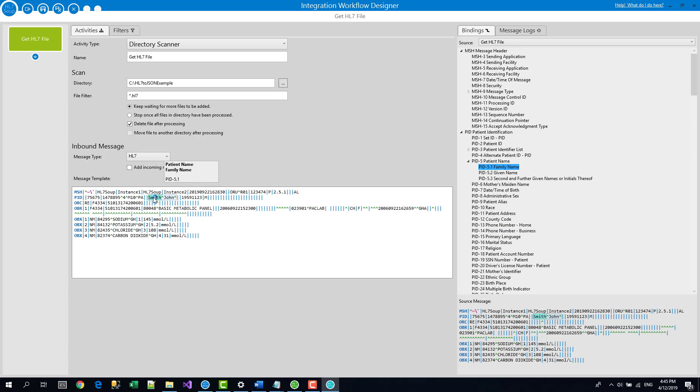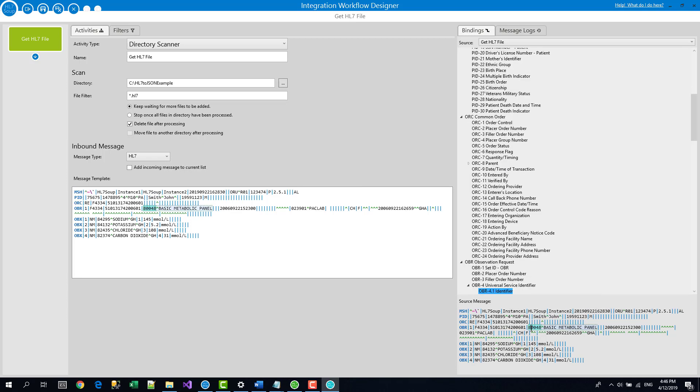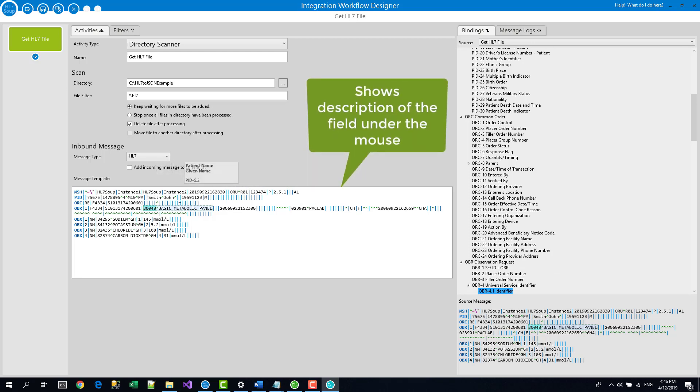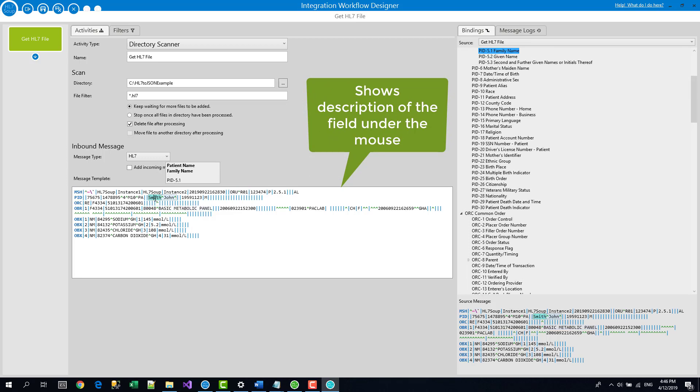Vice versa, if I click on something in the message template, it highlights back in the tree. And there's also the search message one. And that's handy because we won't always be able to see the message template as we're working through this. Another thing that's helpful to notice is as you move your mouse over the HL7 message, you automatically get a highlight of where you are inside the message so you can easily find what you're looking at.